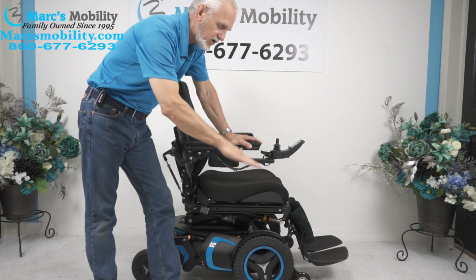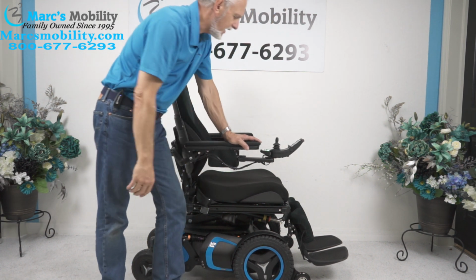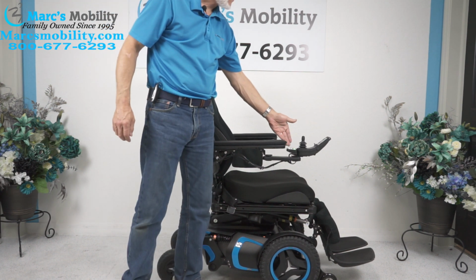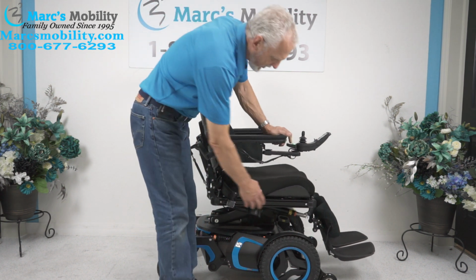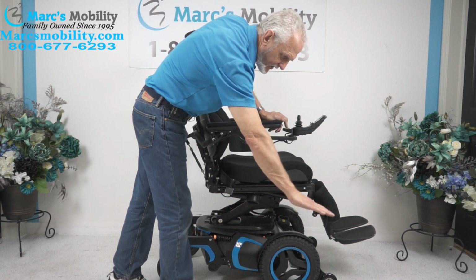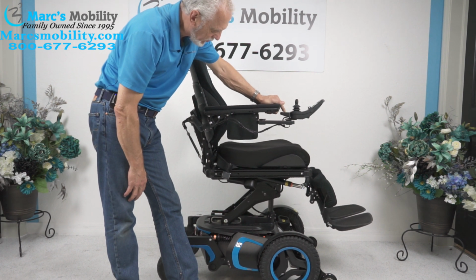It has the 14-inch seat lift, the electric tilt, the electric recline, the electric feet. Okay, 4 electrical functions. All the functions can be worked through the joystick right here. So the first button is the seat lift. I'm going to raise it up. So when you're going up, the seat on this one's a little high. It starts at 23. So if you go 14 inches, you'll be at roughly about 37 inches by the time you're all the way up.